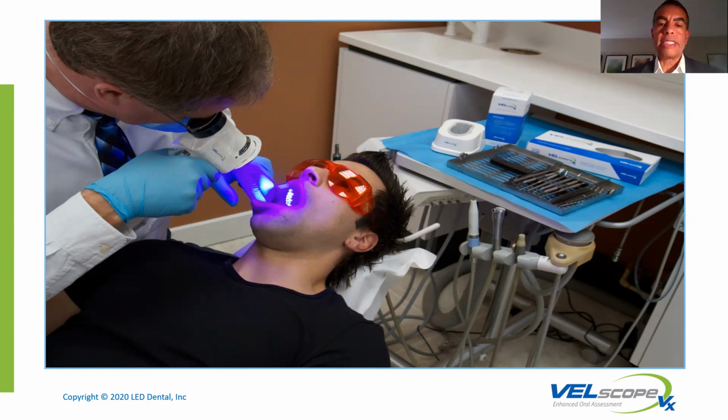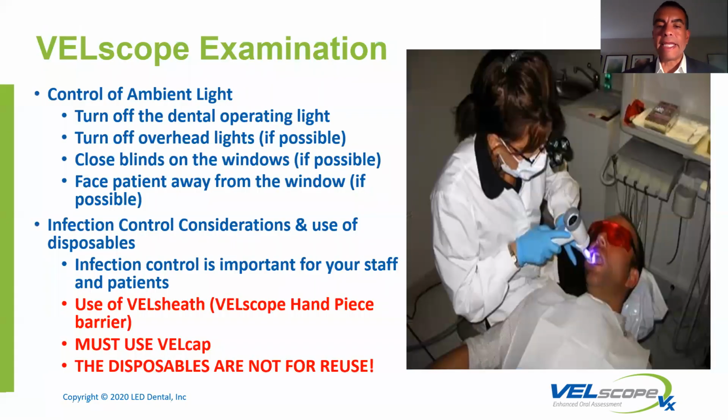One of the things I would stress is let the patients know ahead of time before you start. Mrs. Smith, you're going to hear a little fan, you're going to feel a little warmth, but it's completely safe. There's no radiation, nothing to cause any discomfort or damage to cells or pain. It's just a simple blue light that helps us see better, something of that nature.